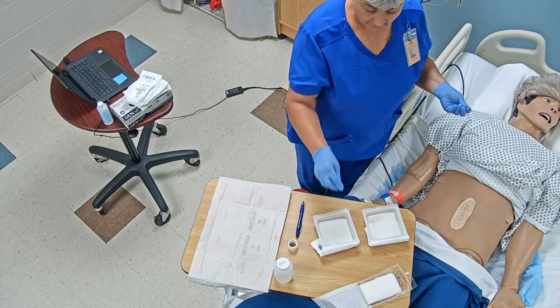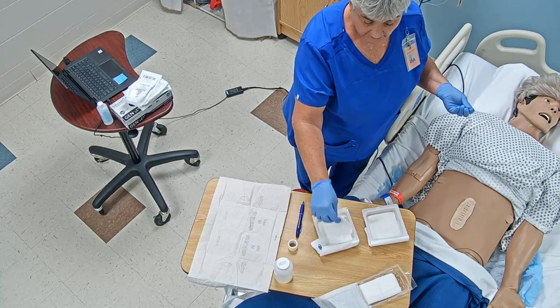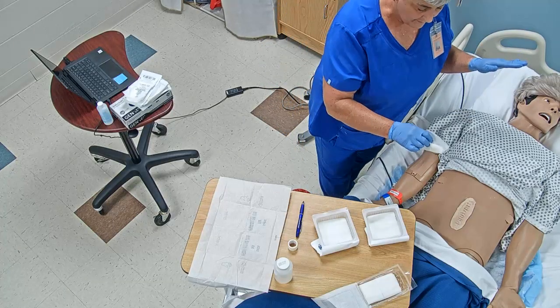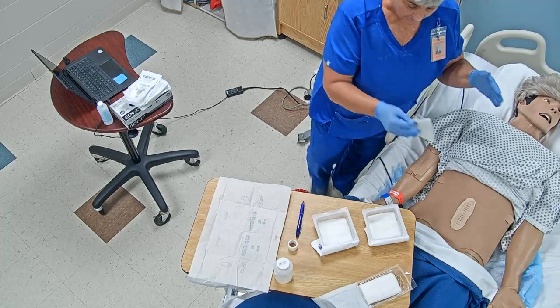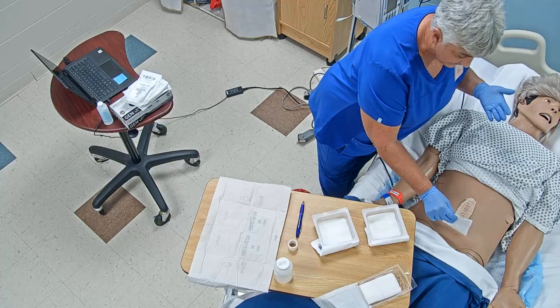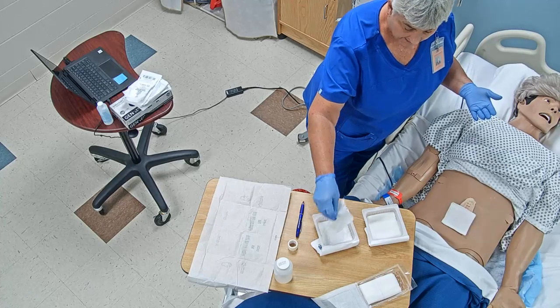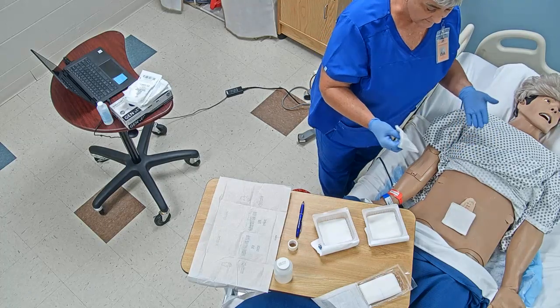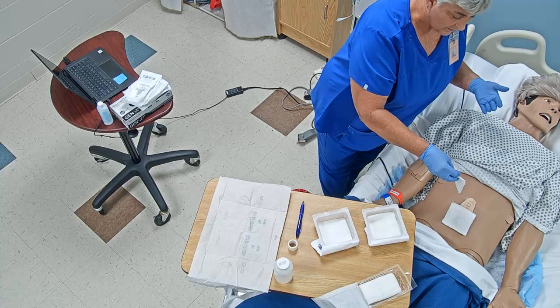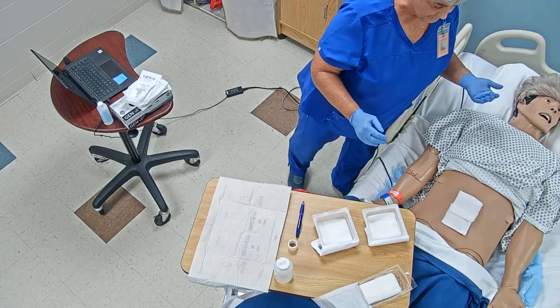Okay, so I'm going to go ahead and get my 4x4. So we finished cleaning. I'm not going to go back to the wound with this hand. So I'm going to use this hand right here. And I'm going to step back so I'm not turning my back on any of my sterile supplies. And I'm going to make sure I cover the wound. Where it lays, it stays, okay? I don't want to be moving that around because I don't want it moving around and bringing bacteria to, even though I've cleaned it, we don't want to bring bacteria into that. So I'm going to use as many as I need to, okay?